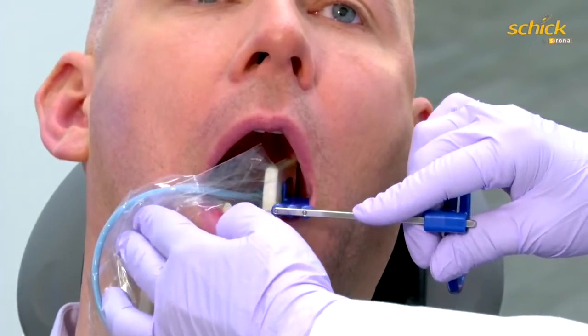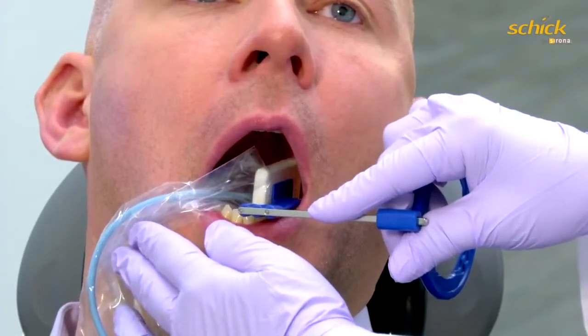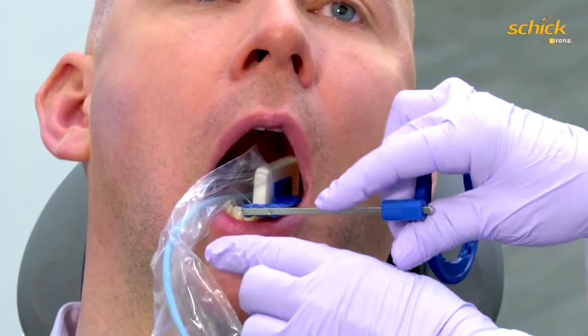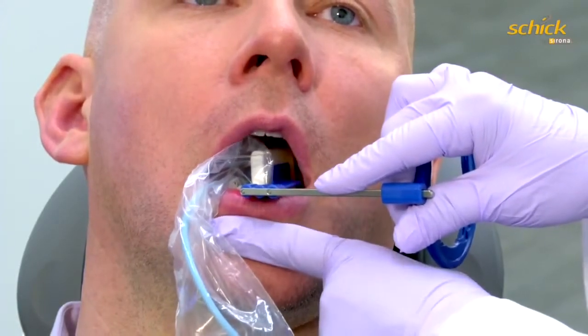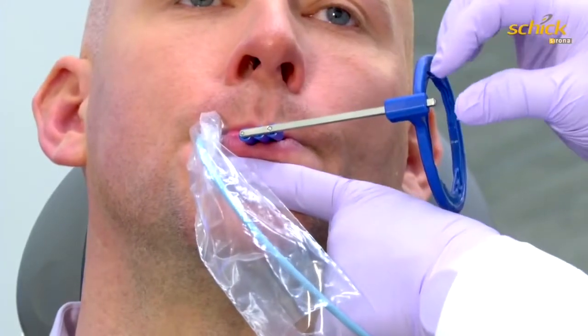And then right before the patient closes, we're going to swing the front edge of the sensor toward the middle of the mouth to follow the curve of Spee and make sure that we break open the contacts in the bitewing. As the patient's closing to pressure on their back teeth, we're going to make sure that we put our index finger under the patient's lips and push so that the patient is in centric occlusion.